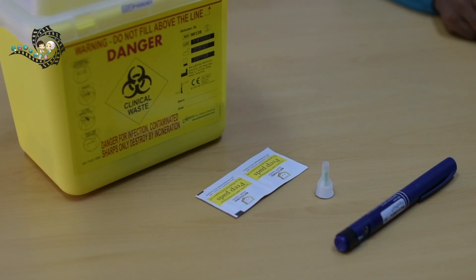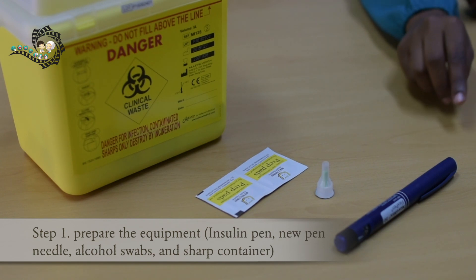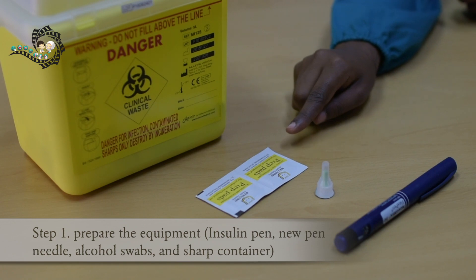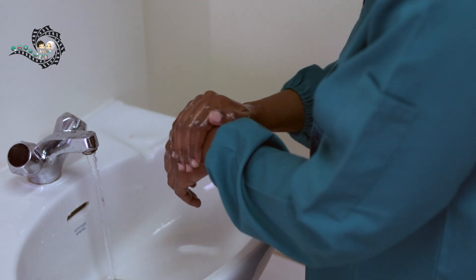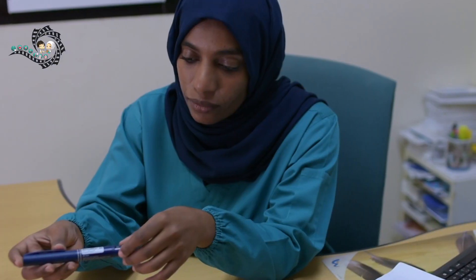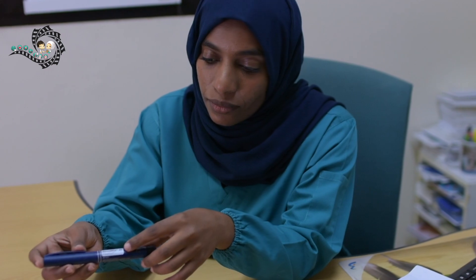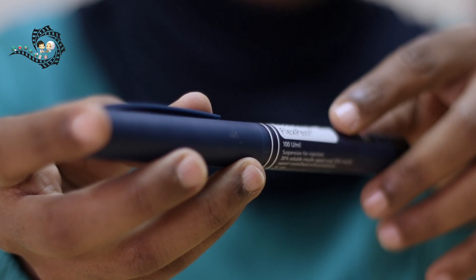To give an insulin injection using an insulin pen, there are six important steps to follow. Step 1: Prepare the equipment. You will need an insulin pen, a new pen needle, a couple of alcohol swabs, and a sharp container. Wash your hands with soap and warm water. Check the pen label to make sure it is the correct insulin type prescribed. Also check the expiry and opening date before giving the injection.